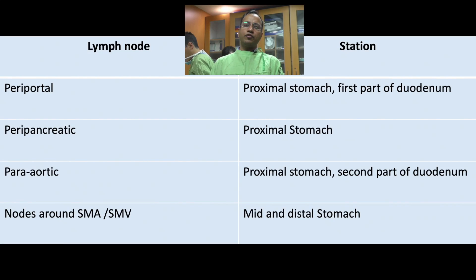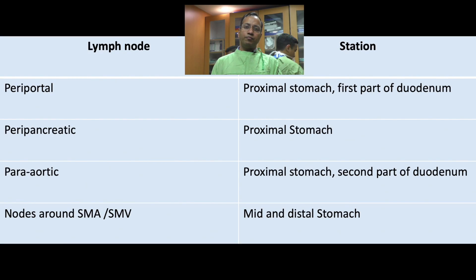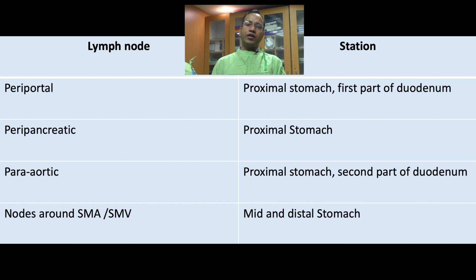Today we are going to demonstrate how we can evaluate various abdominal lymph nodes with endoscopic ultrasound. We will learn how to focus on periportal, peripancreatic, and aortocaval lymph nodes.